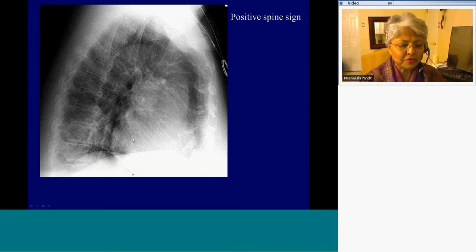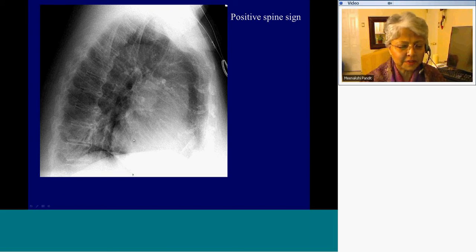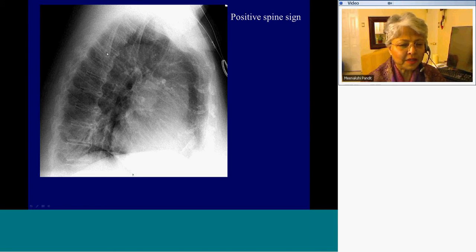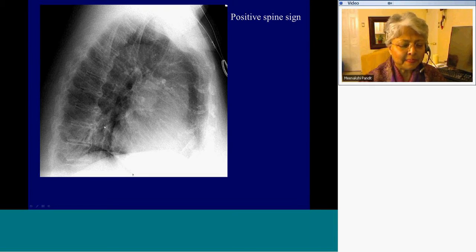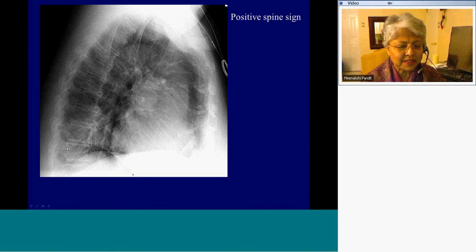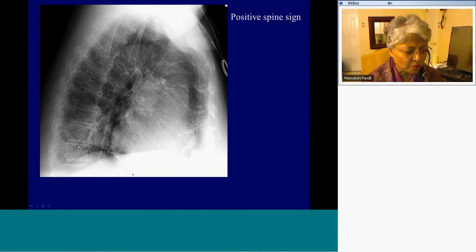Another sign to remember is the positive spine sign, where when you go up the spine, instead of the density increasing — getting whiter — you see a white area and then it becomes darker again. That's the positive spine sign. In this example, you can see there is increased density in the lower regions with an air bronchogram caused by right lower lobe pneumonia.